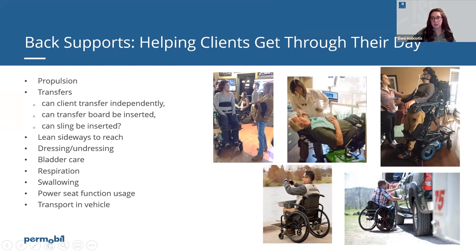Transportation to a vehicle, do they drive a big pickup truck and they need something lightweight that they can load in and out of themselves? Do they never need to fold up their chair? And maybe that will tell us what type of hardware the back support is mounted onto the system with. If they never need to fold it up and they have a lot of tone and they're very heavy on their equipment, maybe fixed hardware would be most appropriate for mounting the back support as opposed to adjustable removable hardware.